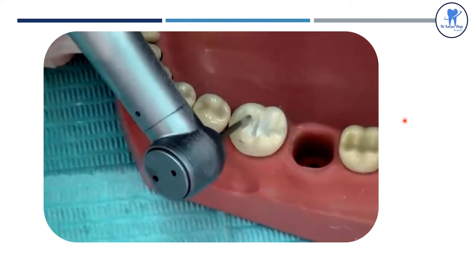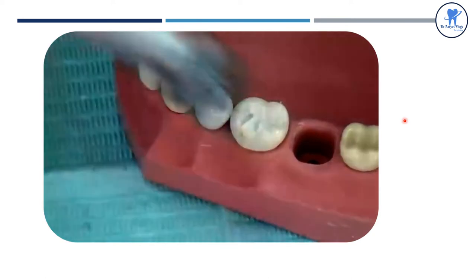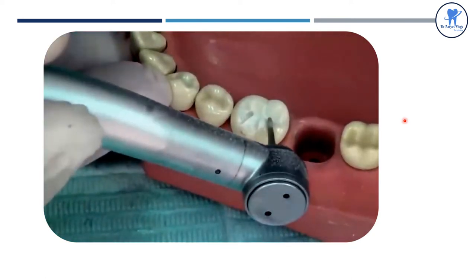First, the depth grooves are placed, noting that the grooves are deeper in the functional cusp area.